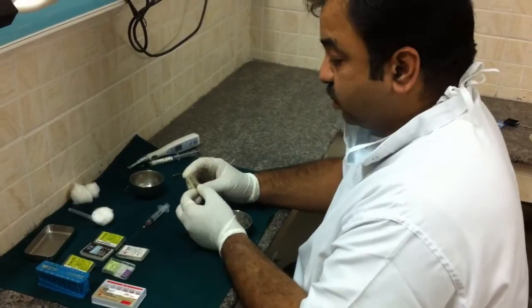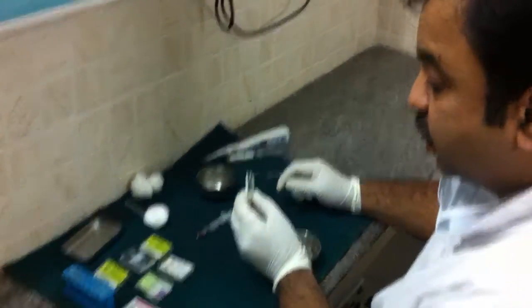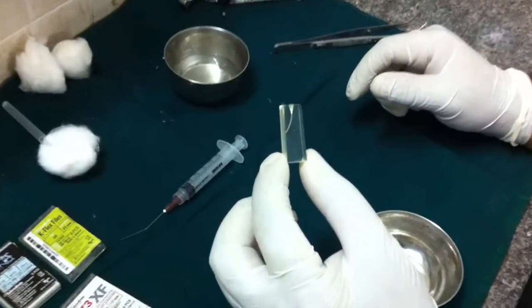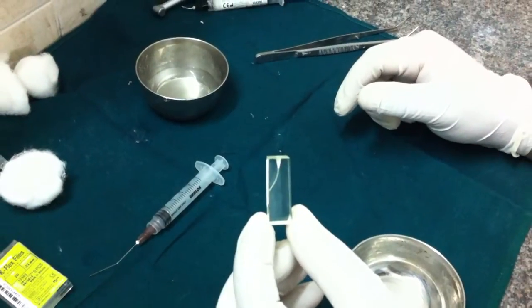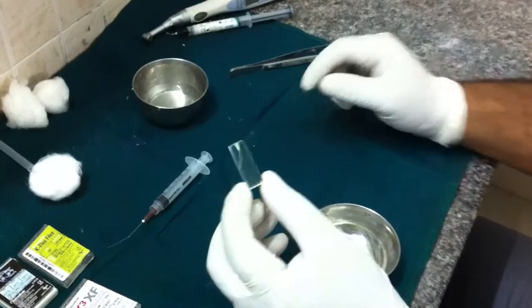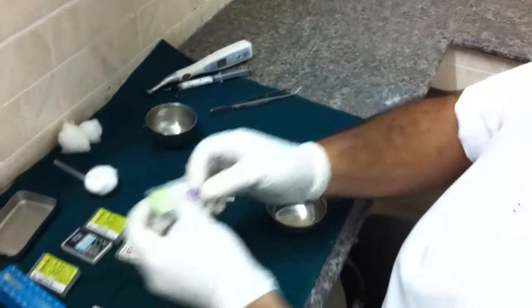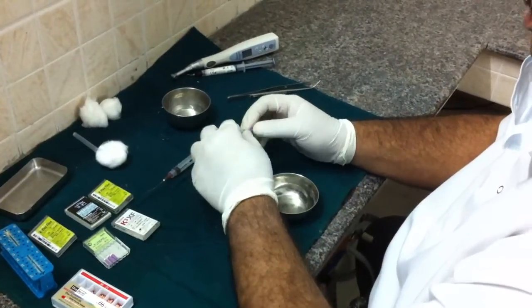I'm going to completely show you and demonstrate a hands-on sequence for the twisted file from Sybron Endo using an acrylic block. This is an uninstrumented acrylic block. You can see here. To start with, the first step is to establish patency using a 10 size K file.